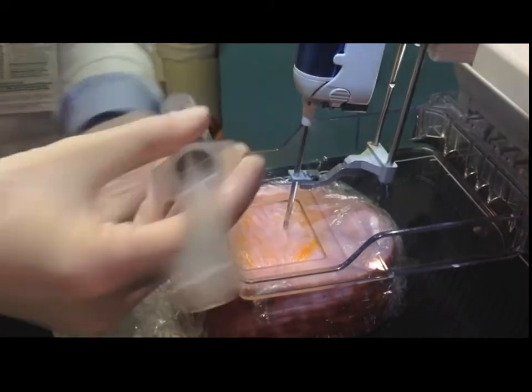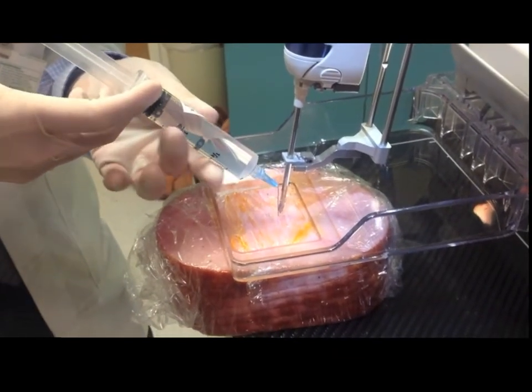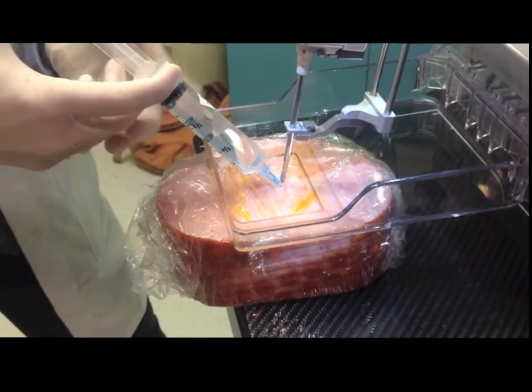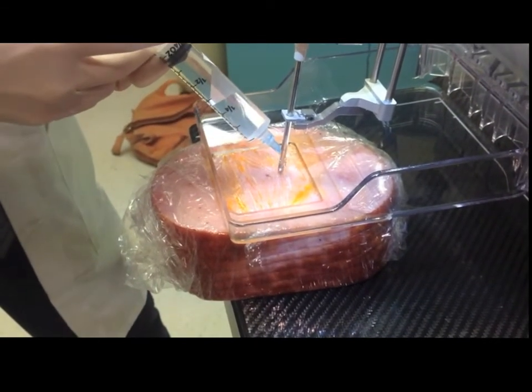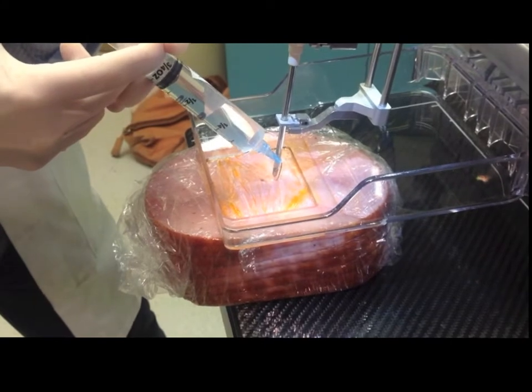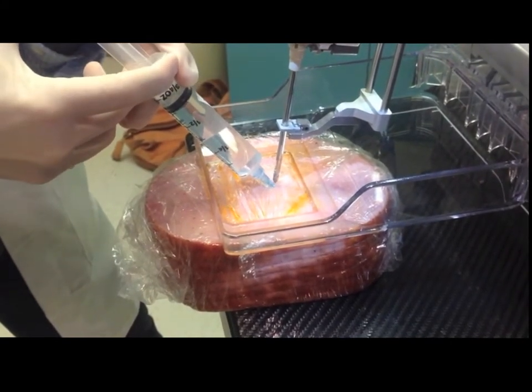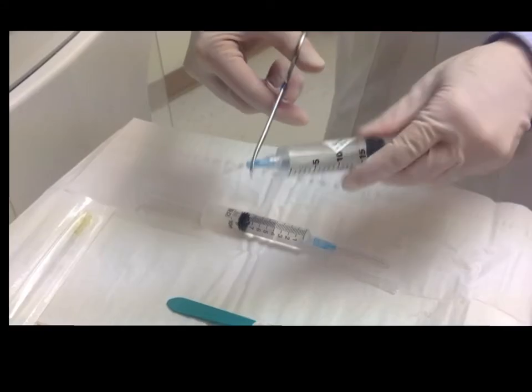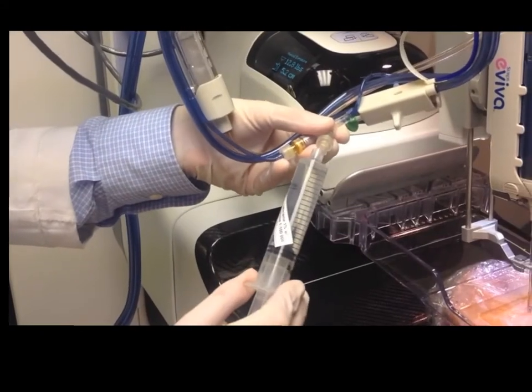We then change to 1% lidocaine with epinephrine and inject about another 5 cc's, maybe up to 7 cc's, this time deeper to make sure that you go to full needle depth and as you can see Jason here is injecting around the needle as we go. The remainder of that syringe 1% lidocaine with epi goes onto the back injection.